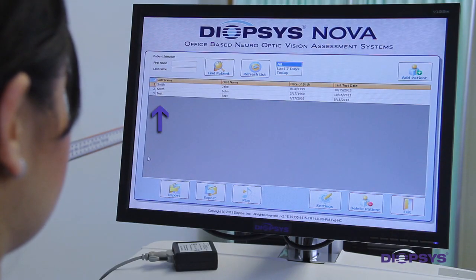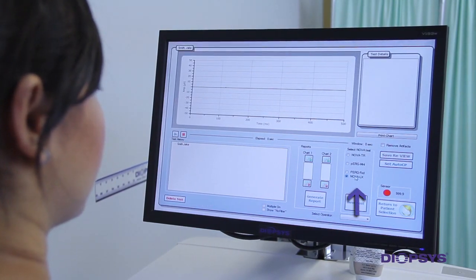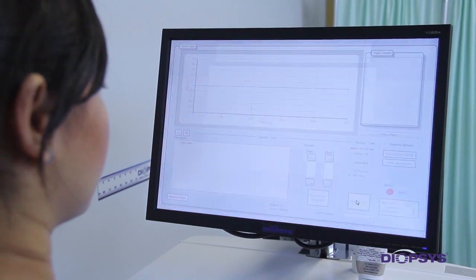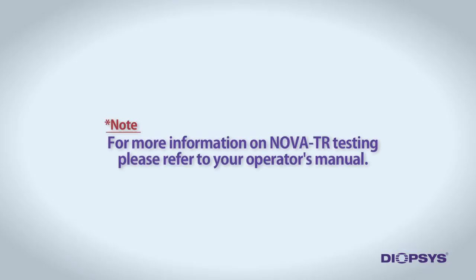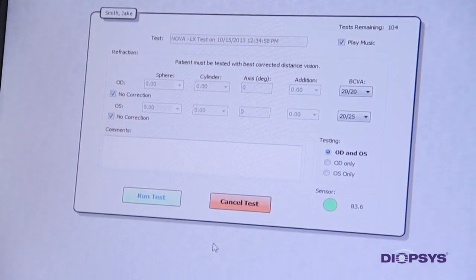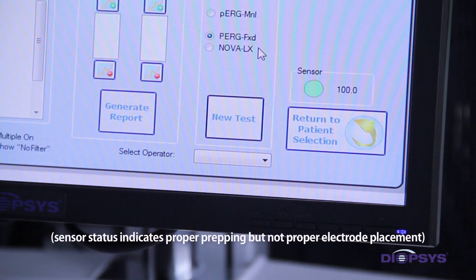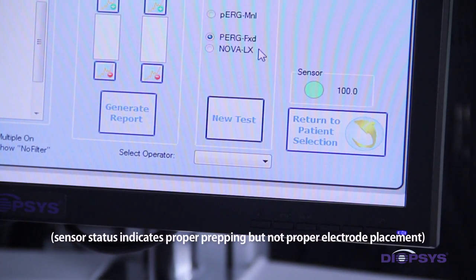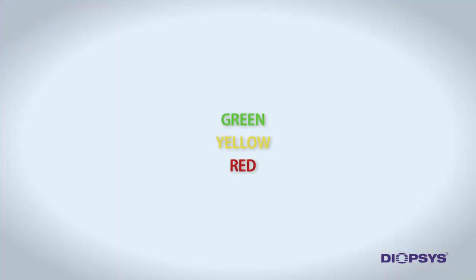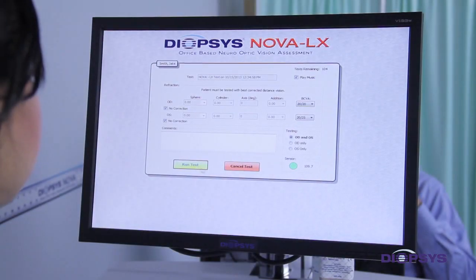Double-click on the patient's name to get to the Select a Test screen. Under the Select NOVA Test section, select the NOVA LX option and click New Test. For more information on NOVA TR testing, please refer to your operator's manual. Notice the sensor status indicator shown on the testing screen. This sensor status is a measure of the quality of the connection to the patient's head through the electrodes. The sensor has three status levels from best to worst: green, yellow, and red. If the sensor status is not green, testing is possible but strongly discouraged. Click on Run Test to begin.